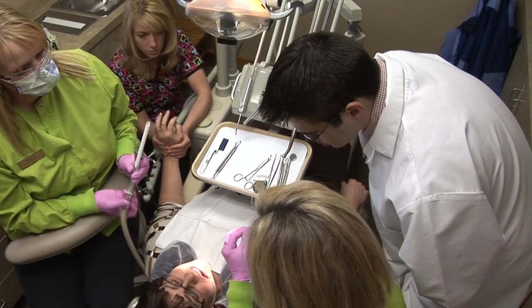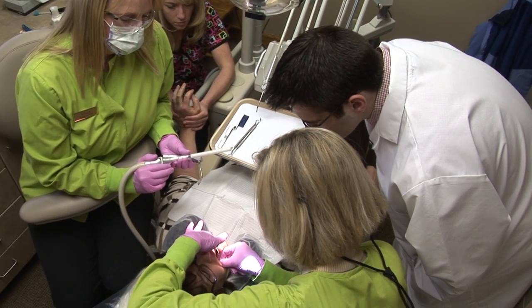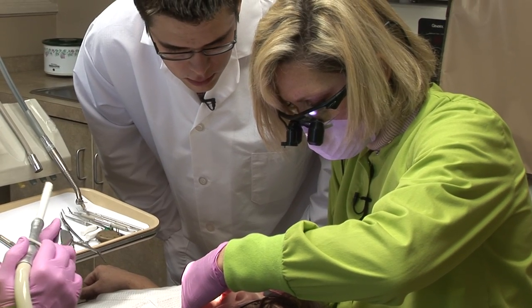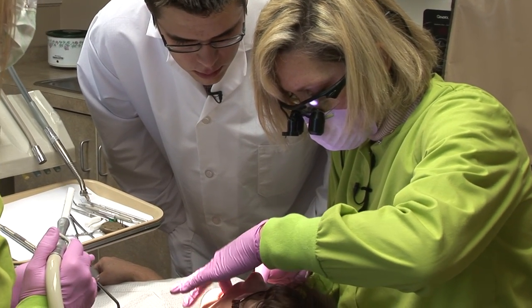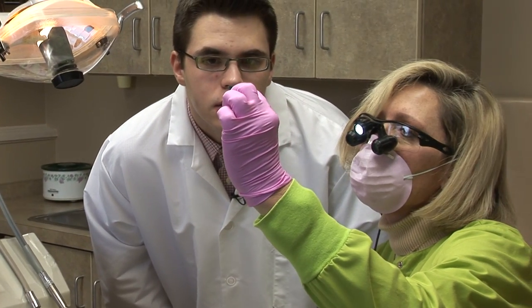So you say, how do you know if you have enough reduction on the biting surface? We put this in here, and I can tell you I don't — I'm just showing you how it works. Bite together. Squeeze and open. And if I don't have enough clearance, she will have bit through that. Do you see where she bit through?